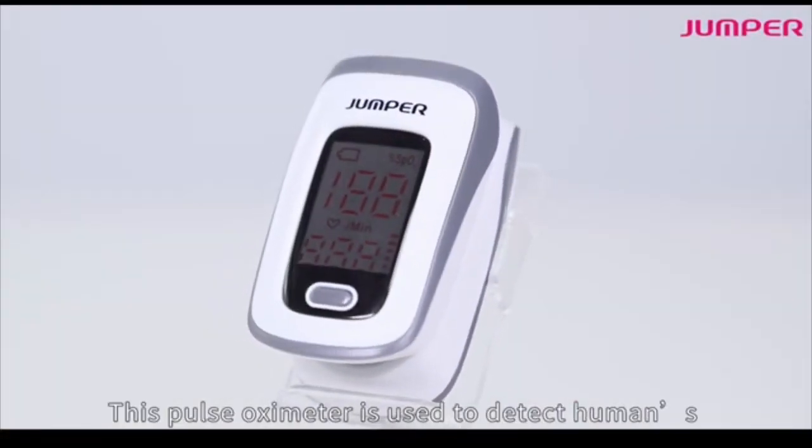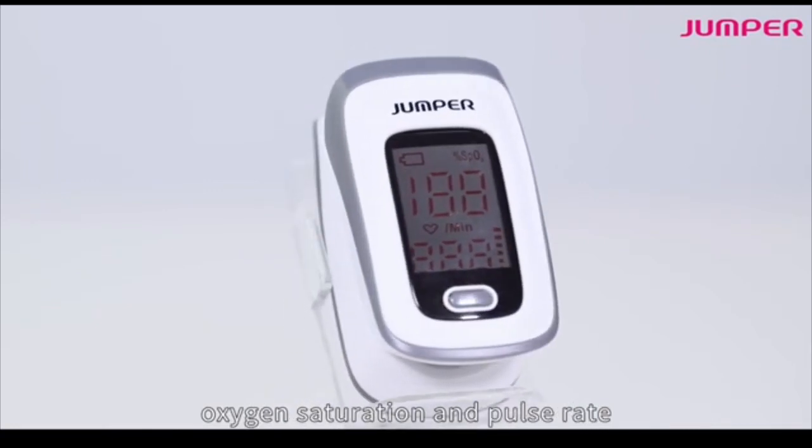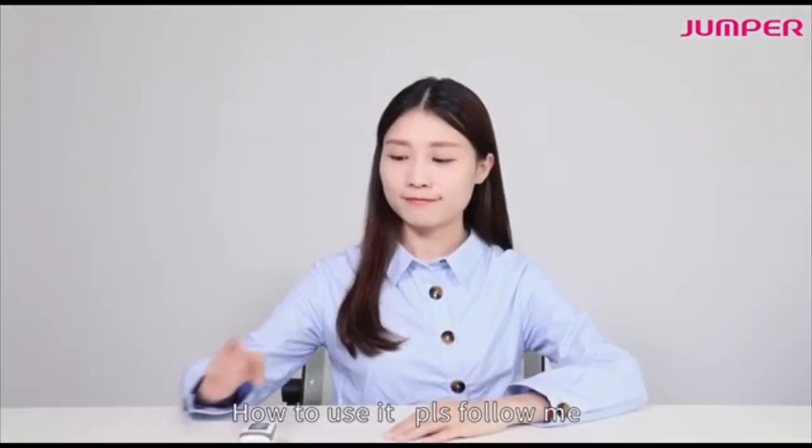Welcome to the Kinetic Approved Jumper Pulse Oximeter. This pulse oximeter is used to check your oxygen saturation and pulse rate. To use it, please follow these instructions.